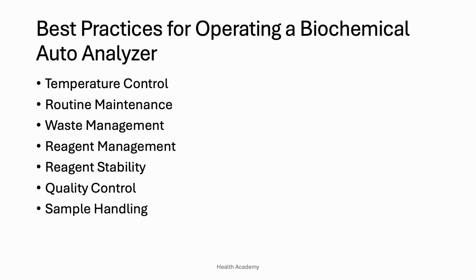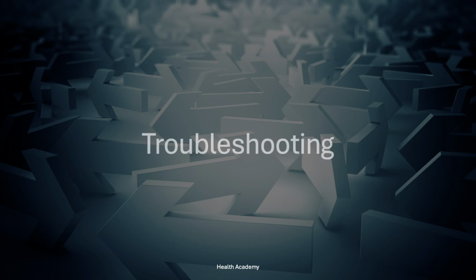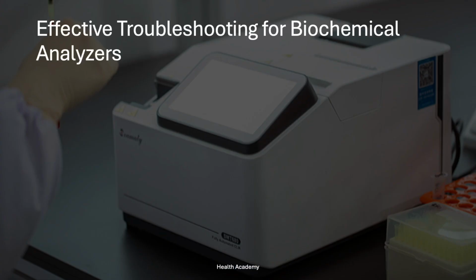Sample handling. Begin sample runs only after ensuring the analyzer is fully functional. Sample quality. Inspect sample quality before analysis. Reject hemolyzed samples and those with clots. Troubleshooting. Effective troubleshooting for biochemical analyzers. Understanding the basics. Familiarize yourself with the analyzer's principles and maintenance protocols for swift issue resolution.